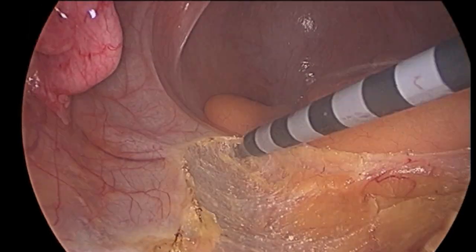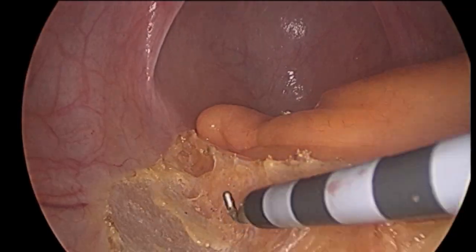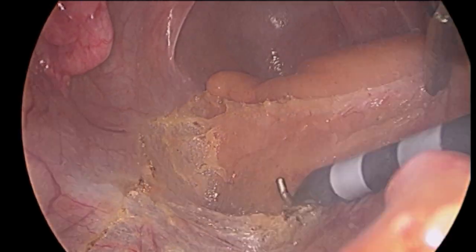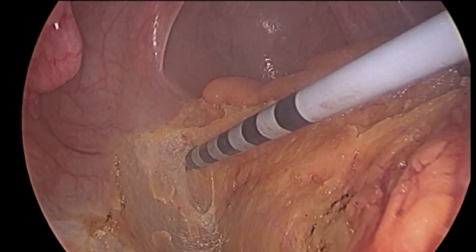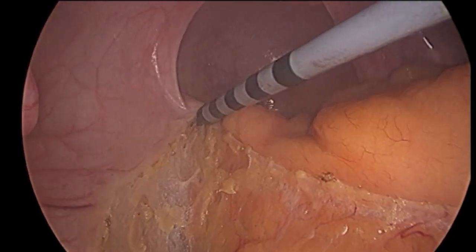Next, the fatty envelope behind the rectum itself — the mesorectum — is carefully dissected away from the bones, blood vessels, and nerves of the pelvis. Since it contains the regional lymph nodes to which rectal cancer first spreads, it will be removed with the rectal tumor and sent to the pathologist for study under the microscope.